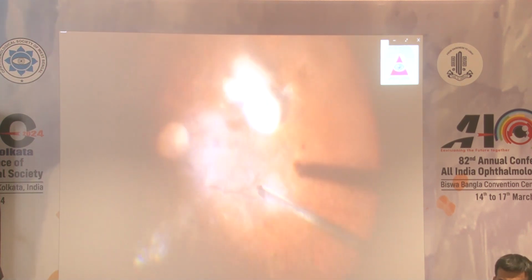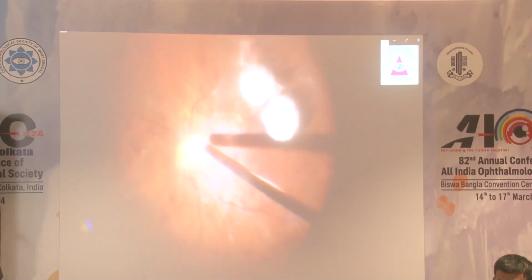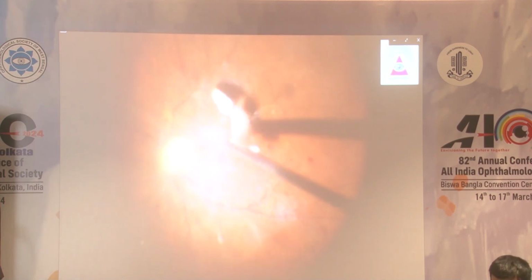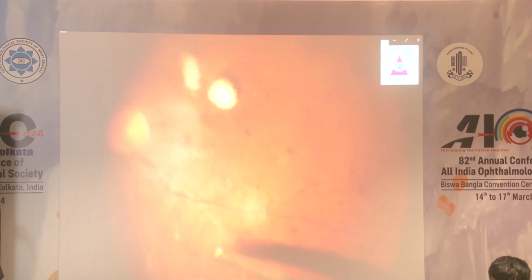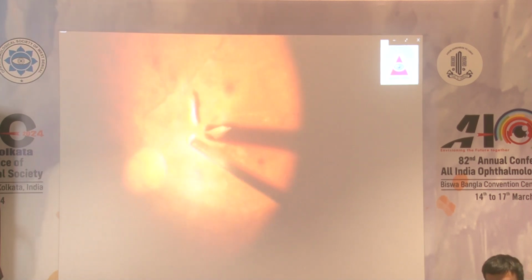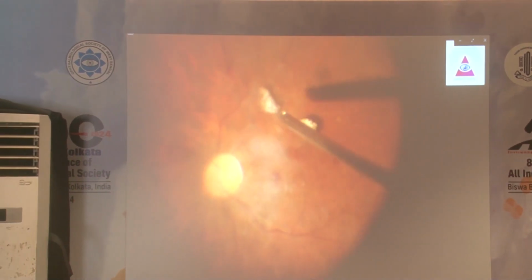As vitreous is adherent to the retina and no PVD is present, normal PVD induction with the cutter might not be possible, and accessory instruments like a soft tip, a pick, or forceps might be useful in inducing PVD in such cases. Also, these are the cases where there are higher chances of creating an iatrogenic break during PVD induction.